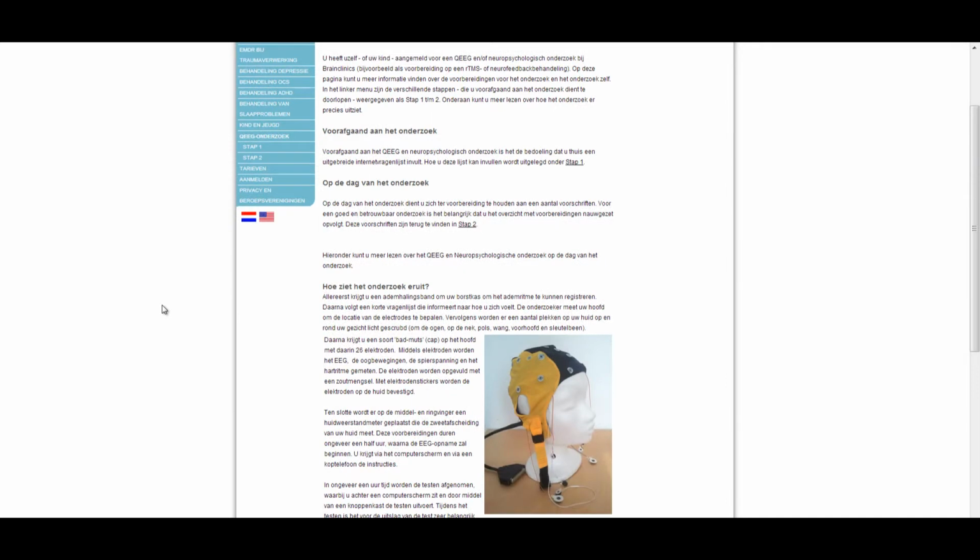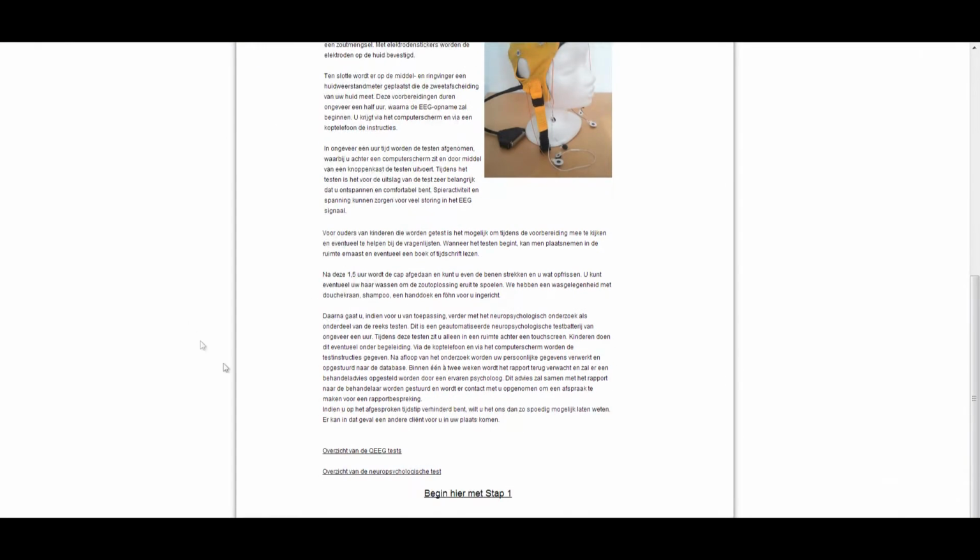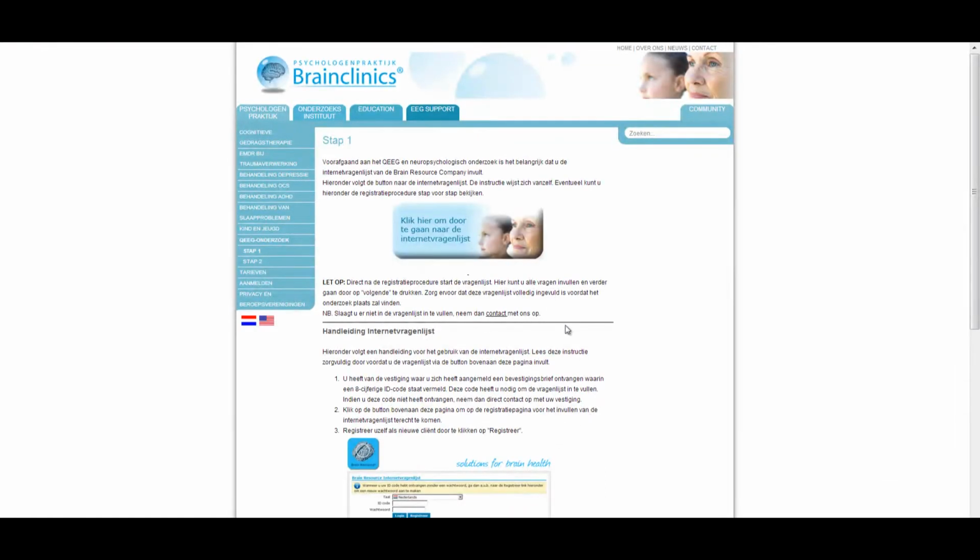Prior to the QEEG, it is important that the client completes the online questionnaire and follows the preparation instructions. These steps can be found on the Brainclinics website.